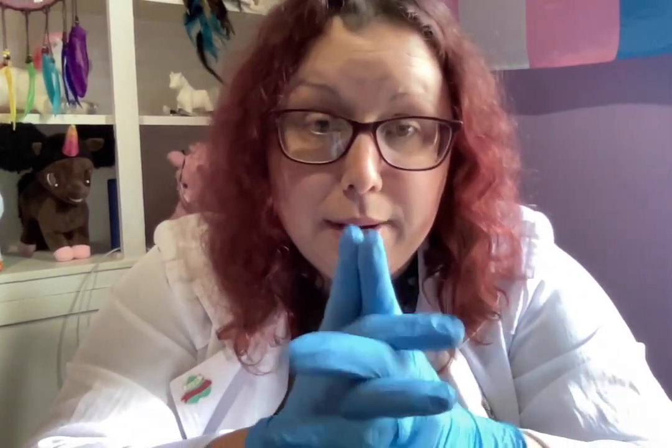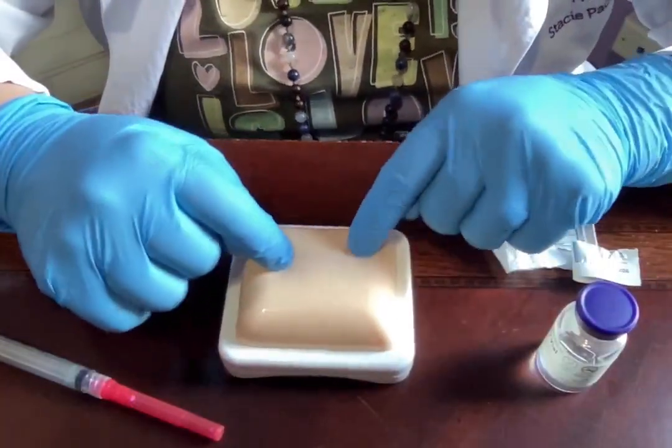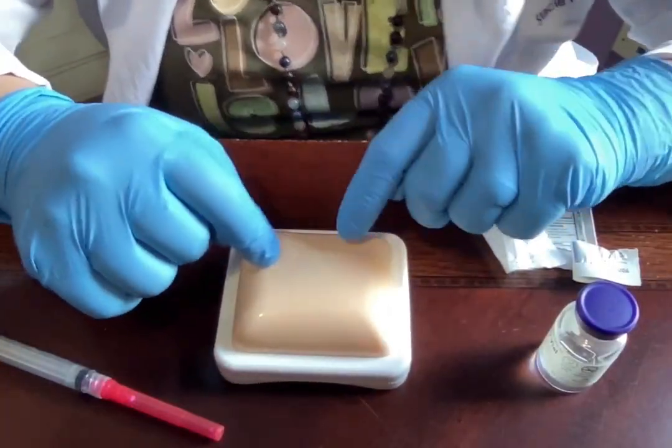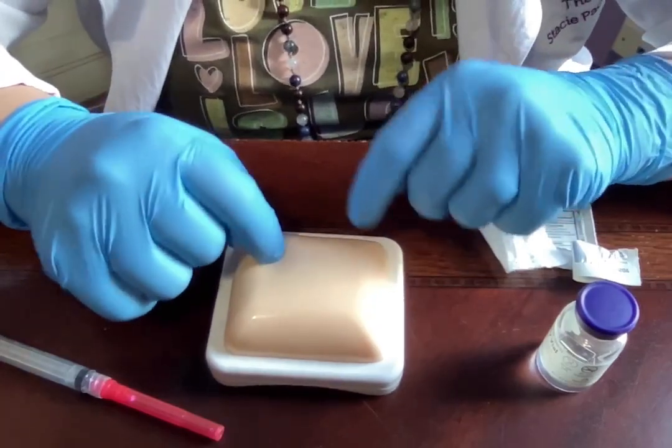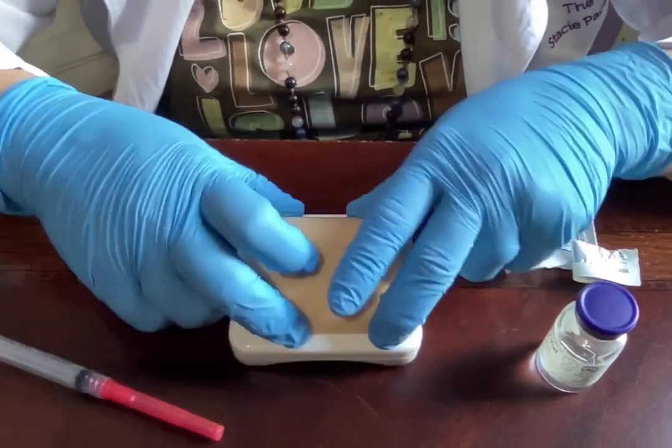First thing to do is wash your hands really well with soap and water for at least 20 seconds before you get started. Now let's look at my supplies. I've got a little fake piece of skin — this represents either your belly, the back chicken-wing part of your arm, the fatty part of the outer thigh, or wherever you'll be injecting.